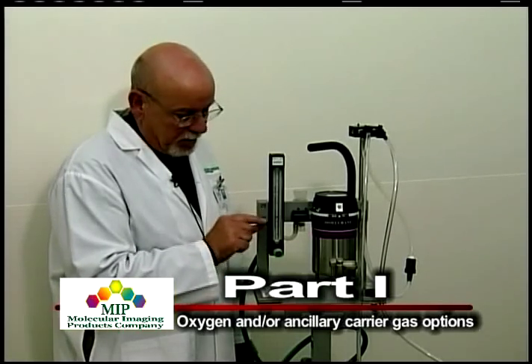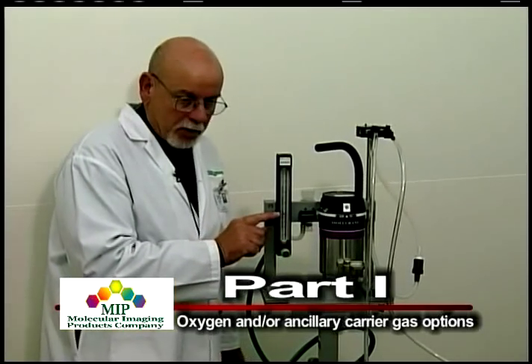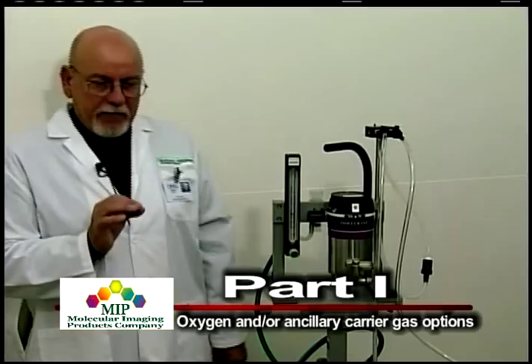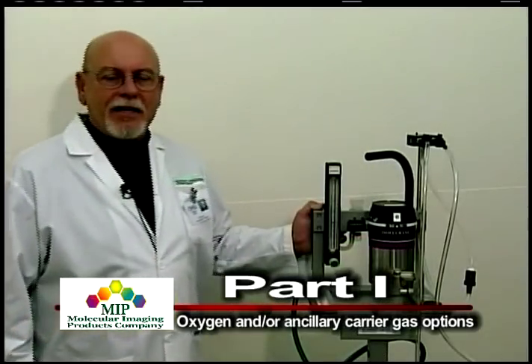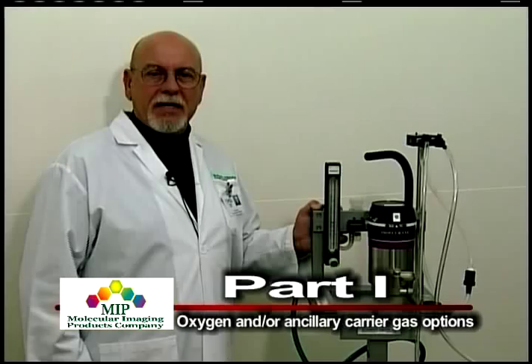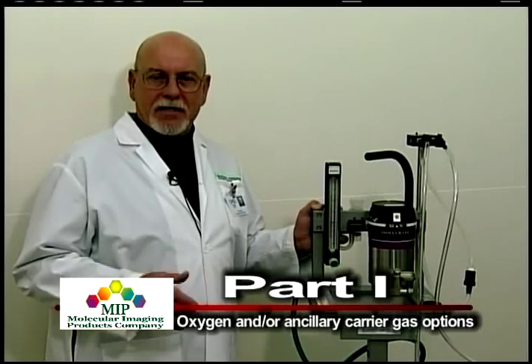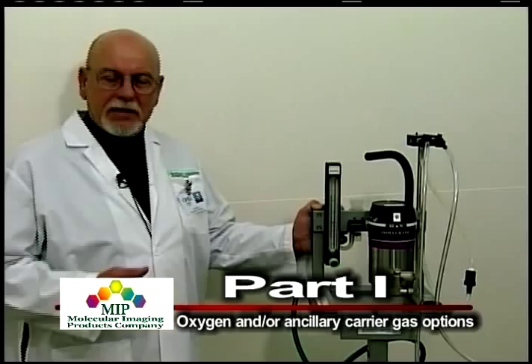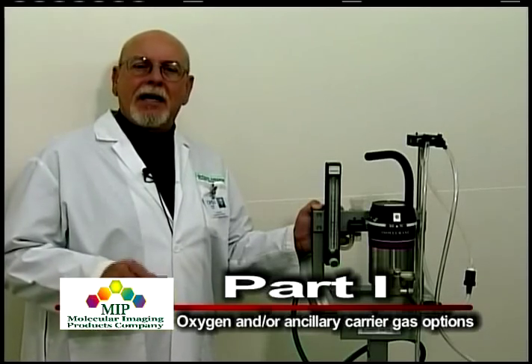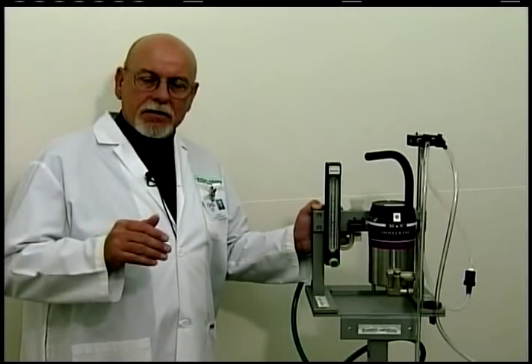This oxygen flow meter can go up to 4 liters per minute, though there's really no need to go that high — in most cases you'll run about 1 liter per minute. At 1 liter per minute flow, an E tank containing approximately 700 liters at 2,100 psi will last approximately 10 hours of anesthesia. The H tank, which is 10 times the volume of an E tank at approximately 7,000 liters, will last just 10 times as long — about 100 hours of anesthesia at 1 liter per minute.